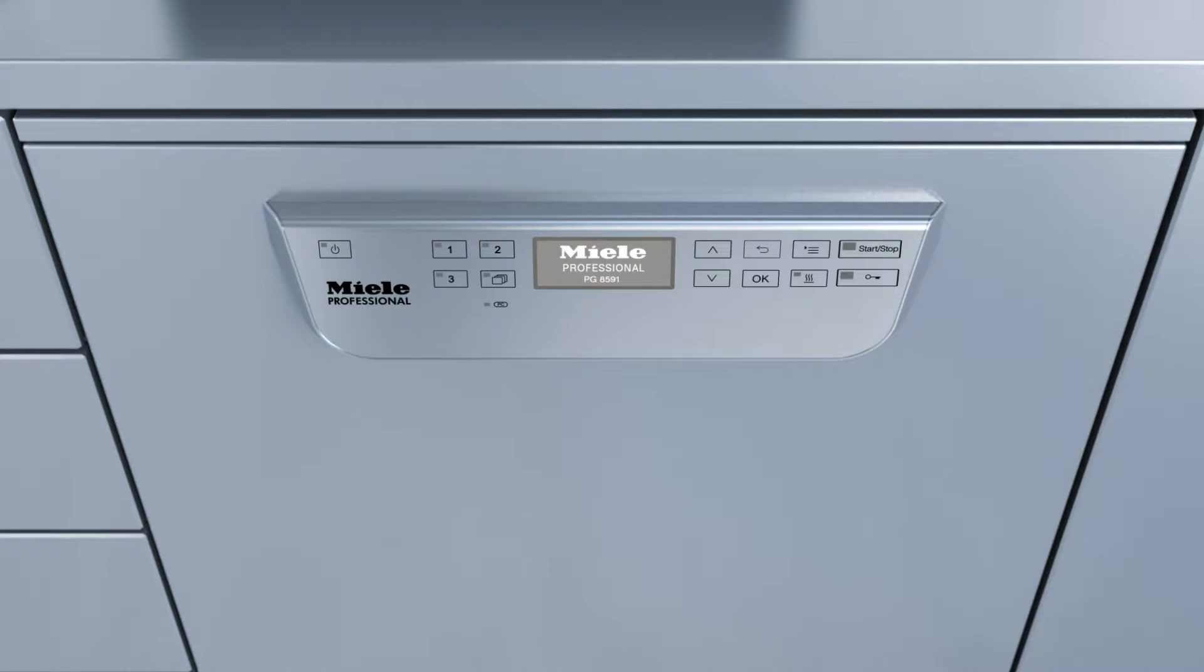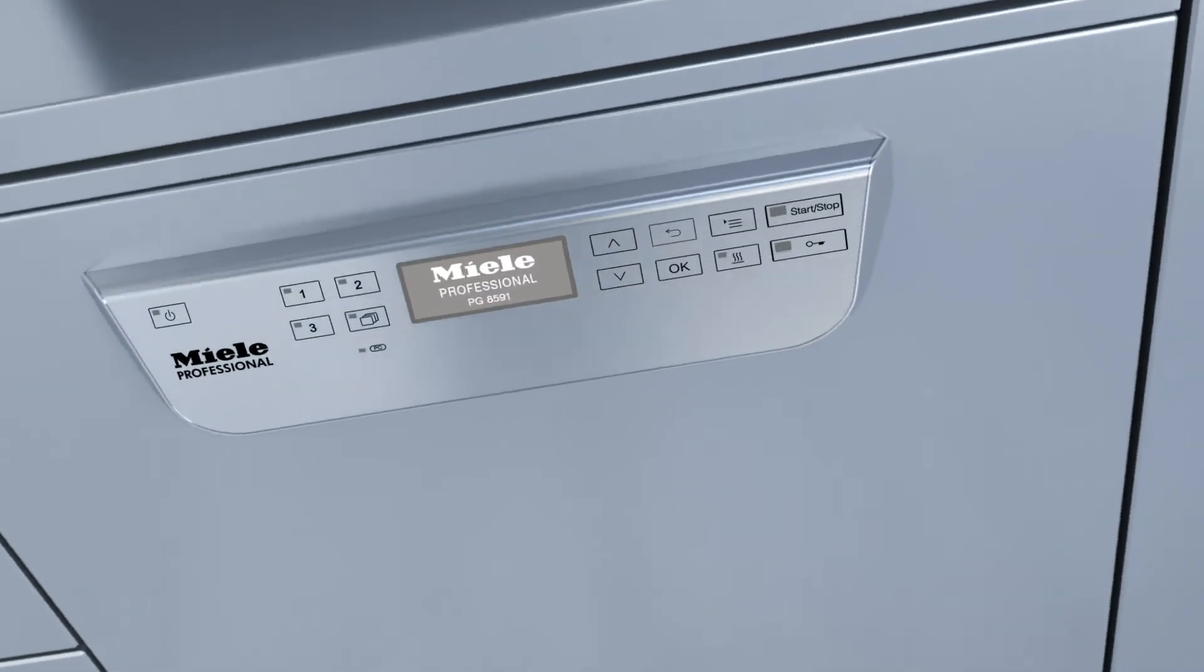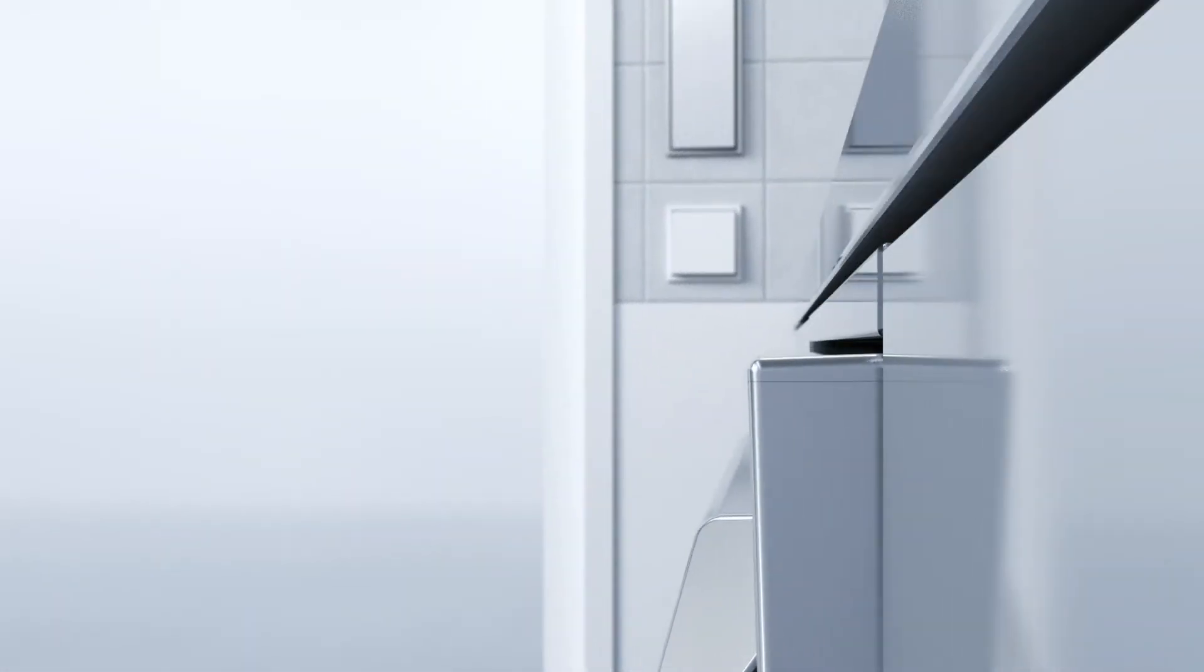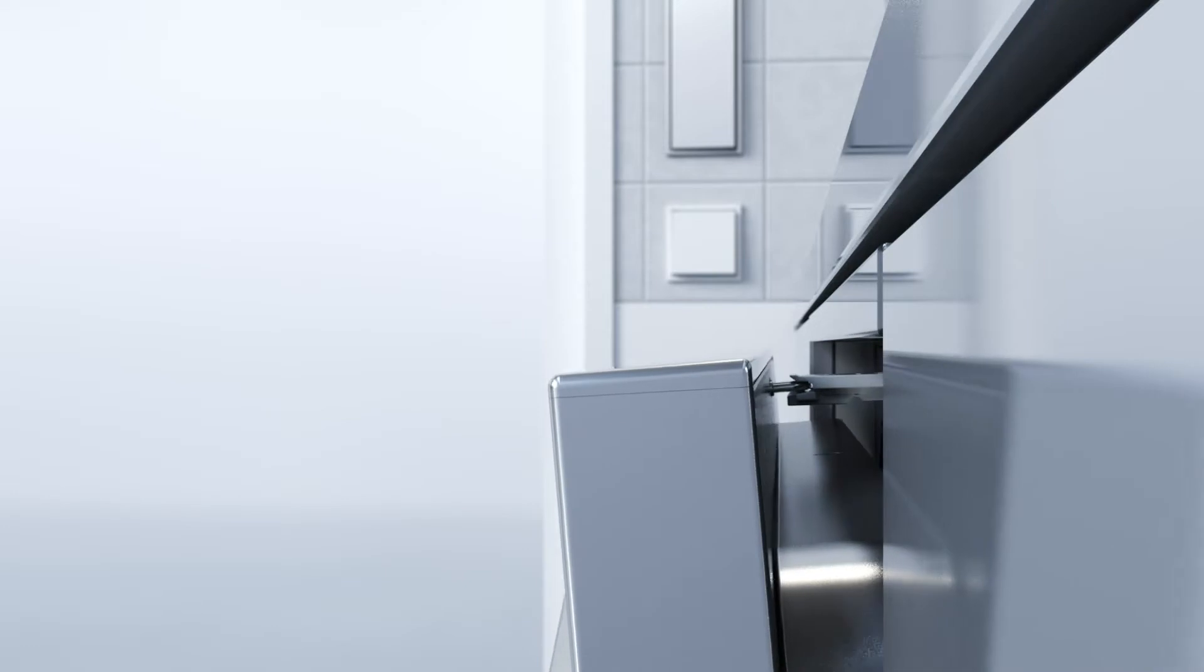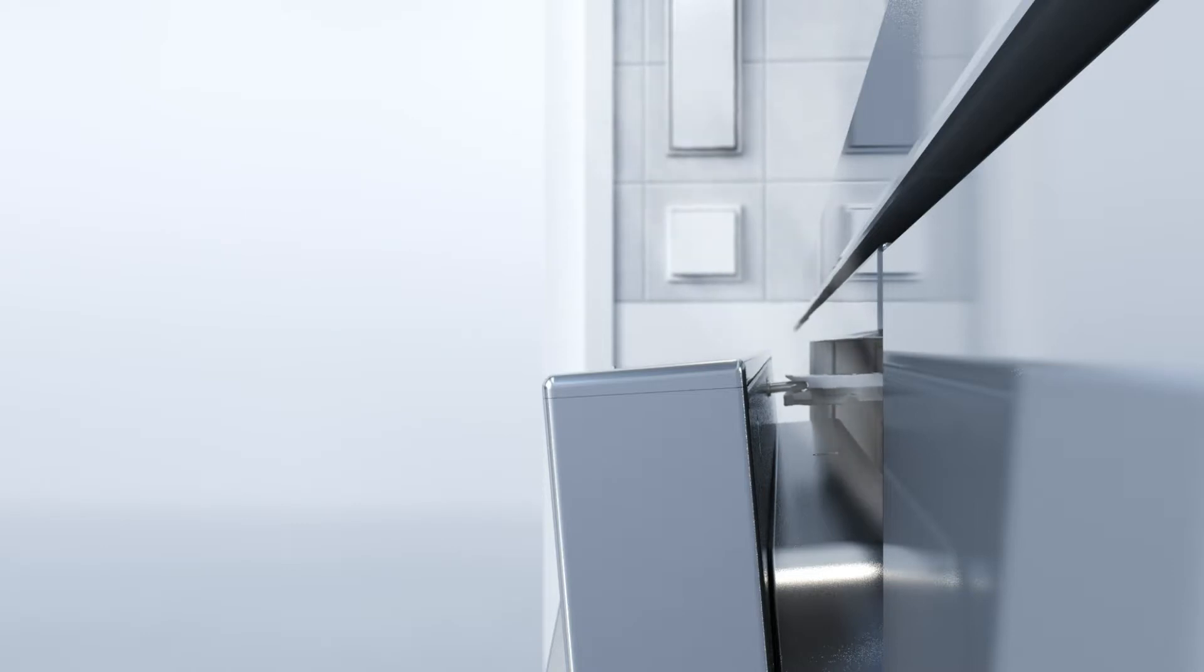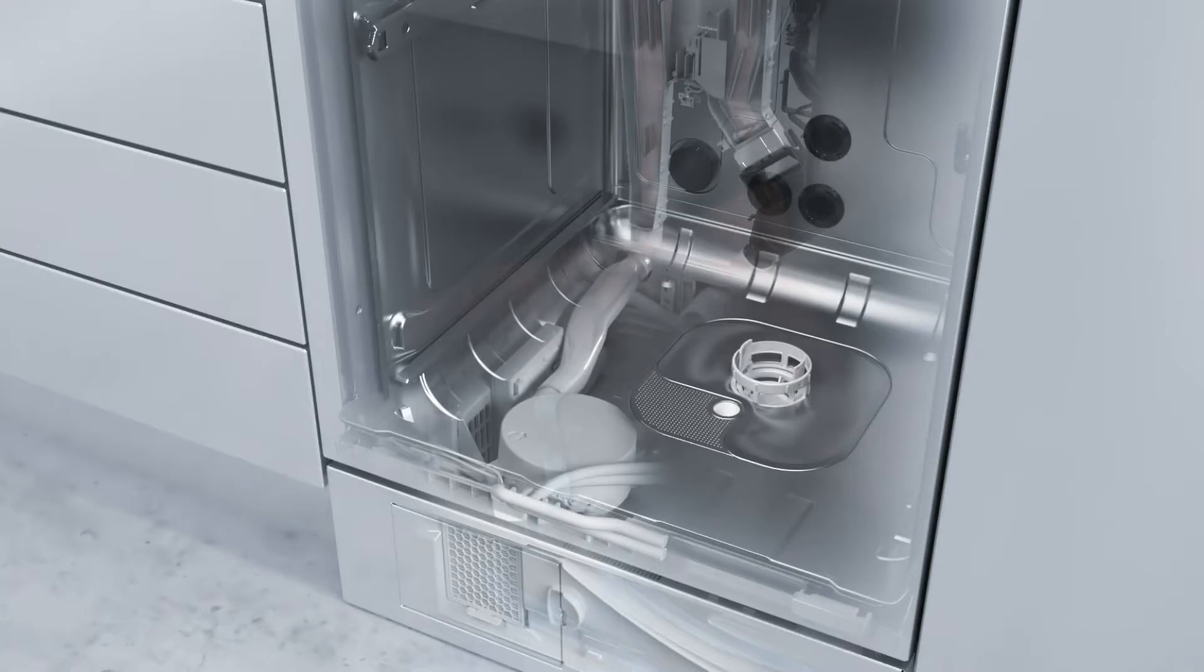The two high performance drying systems deployed on the new washer disinfectors are also highly efficient. On models featuring EcoDry, the door opens automatically at the end of a program, thanks to AutoOpen. This releases hot, moisture-laden air, allowing the load to dry and cool down faster.